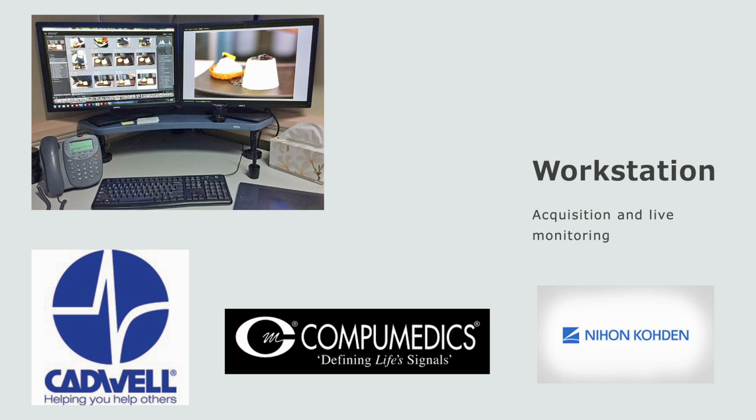This software usually comes in a bundle, meaning there's a program to run a sleep study. There's a program to go back and look through and score the study after it's done. And sometimes a program that just stores and manages all the study files, commonly called the study manager. All these programs do the same thing, but everything is formatted differently.